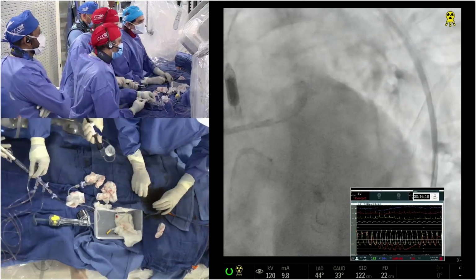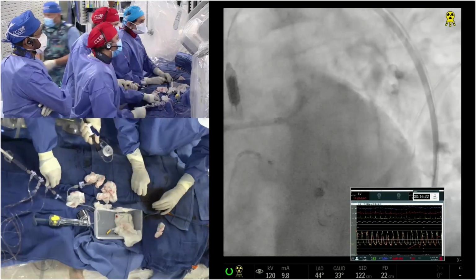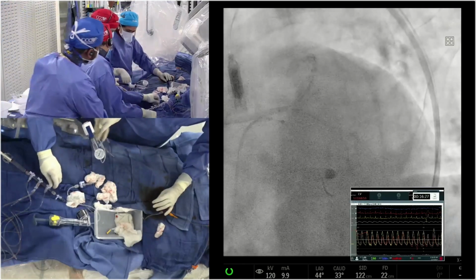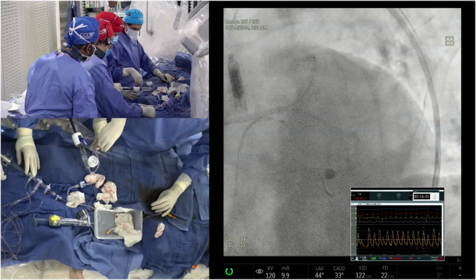Replacement, and at least going up. Three bypasses here, and they turned them down. Which is, hey, that's the reality. Listen. Side branch.